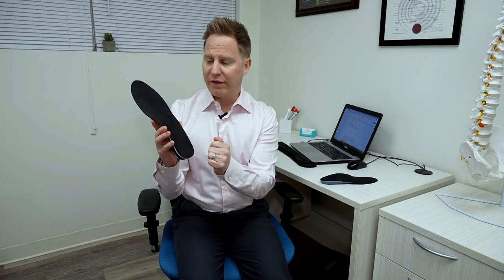So an orthotic looks like this. We can do custom modifications. If someone has a lot of heel pain, we could do extra padding around here. If someone has pain in the ball of their foot — that's called metatarsalgia — we could add extra padding here, which is customized based on the patient's 3D laser foot scan.